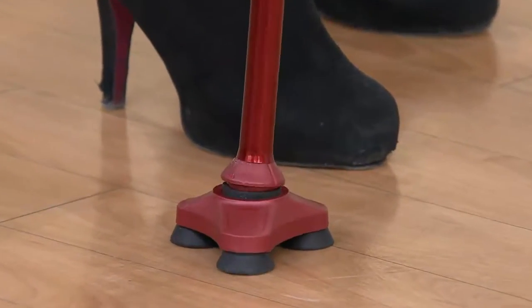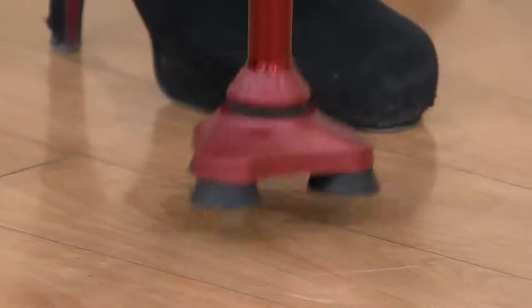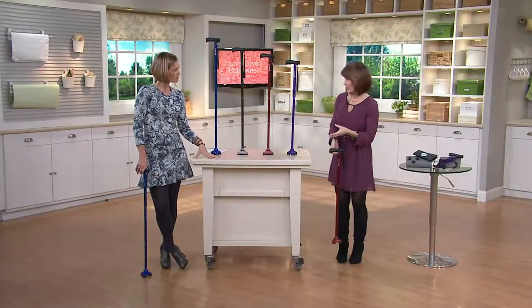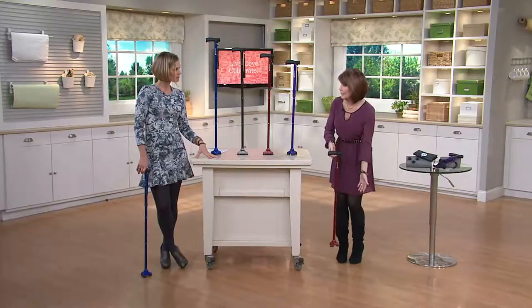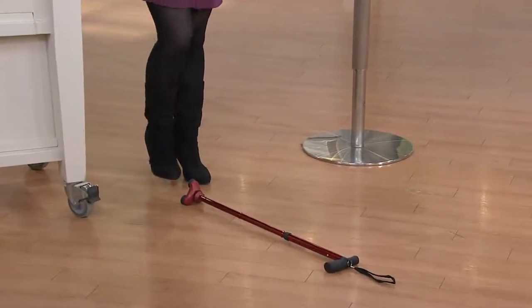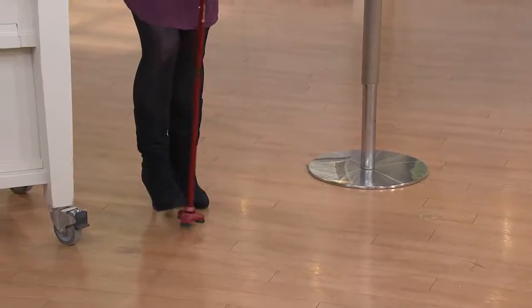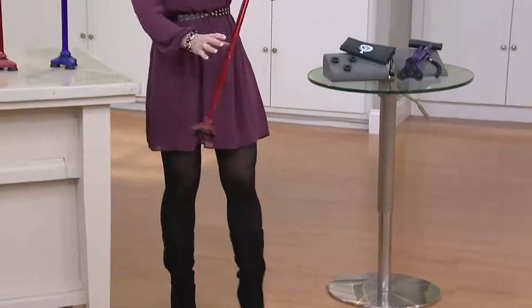Now, if this cane should ever fall over — watch this. This is really cool because, let's face it, if you have a cane, the odds of you being able to bend down and pick it up are probably very slim. So if the cane does fall down, you simply take the ball of your foot, apply a little bit of pressure, and you bring that handle right up to you. It doesn't get any easier than that.